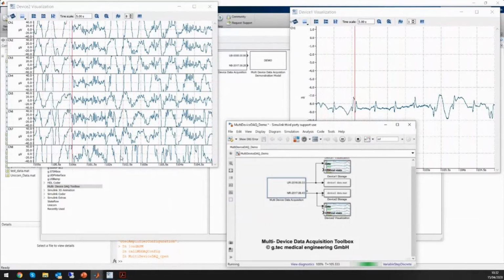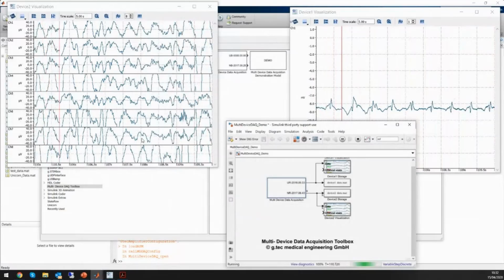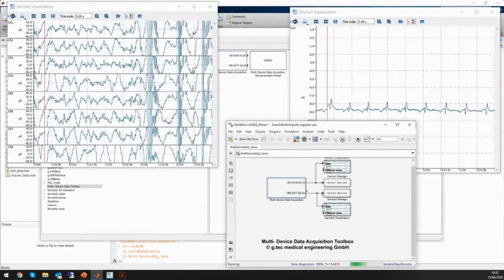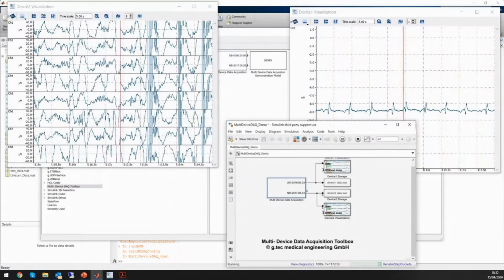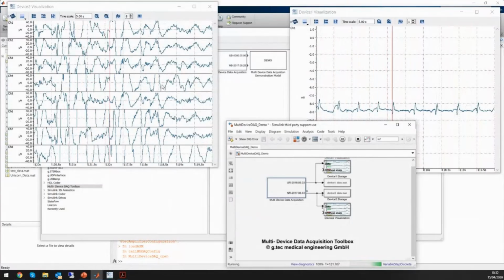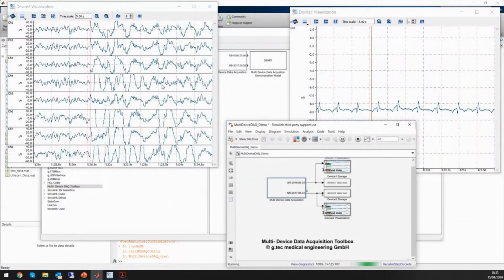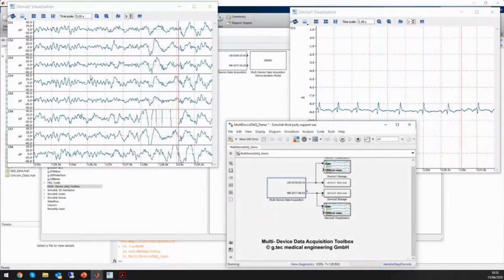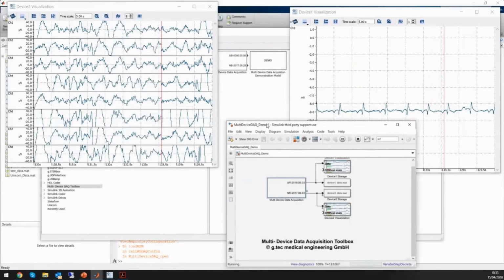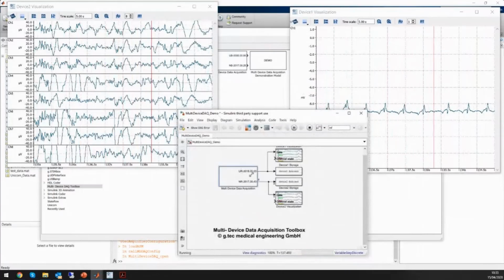So some simple testing for active electrodes. For example, when I bite, the muscle signal should be stronger. So I bite. You can see the signal responds really fast. One more test is the alpha signal. If I close my eyes, you can see the alpha wave really displayed here. So yeah, pretty easy to use in terms of here.